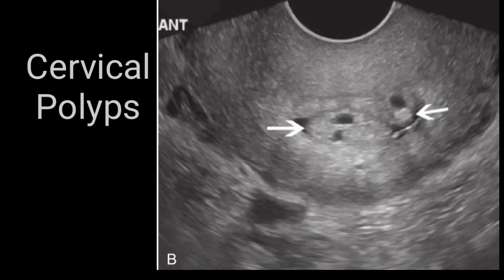On this transvaginal scan, the cervical area is clearly seen. Two echogenic lesions are indicated by white arrows in the cervical canal — these are cervical polyps. Polyps may occur in the cervical region; sometimes they are small, sometimes large enough to protrude out of the external os. These are classical examples of cervical polyps. Cervical polyps usually appear round and echogenic; very rarely will they appear hypoechoic.